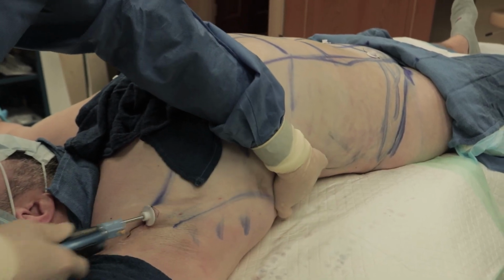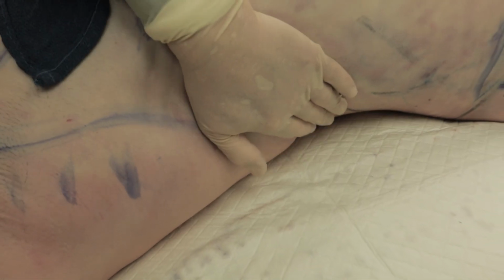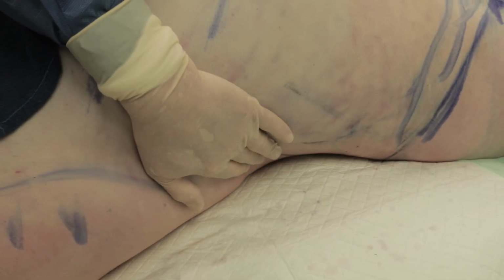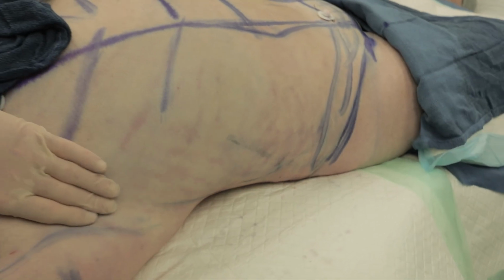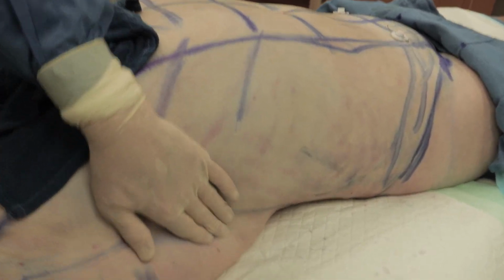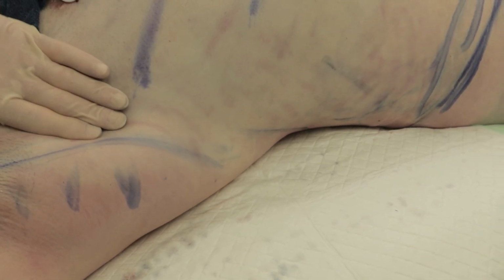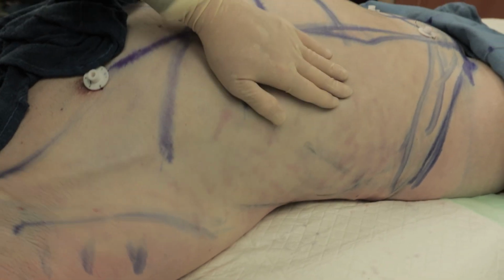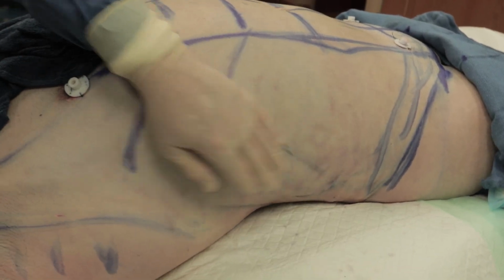So now, look what I'm doing, guys. Rain, come over here. Look, I'm getting way back here. And I haven't turned them on the side yet. We'll do that towards the end. But look what I'm doing with his lats here. Again, I want to maintain volume where I want it. Look at that shape. This is what I'm talking about. This is Lipo Gyno.